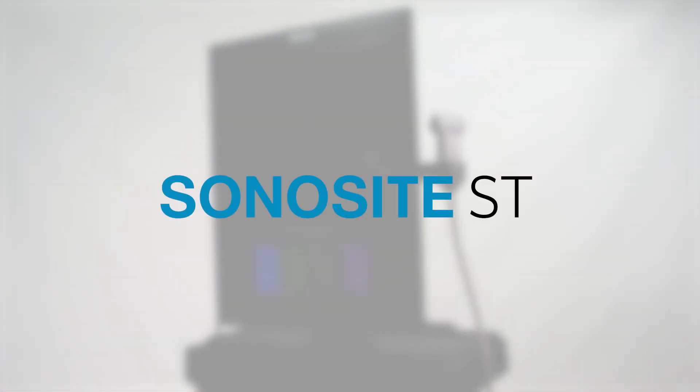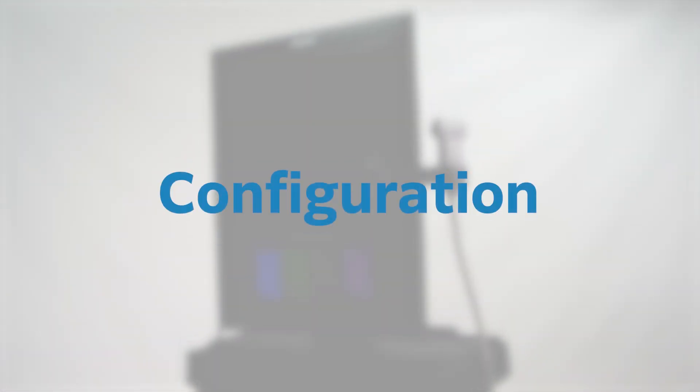Welcome to the help video, Configuration. In this video, we'll show you how to access system settings and make common configuration changes.